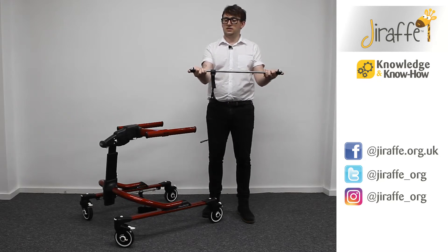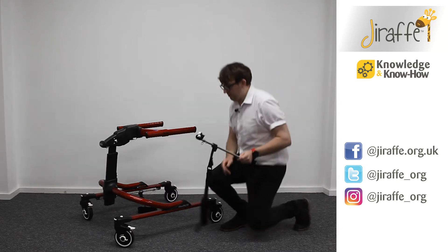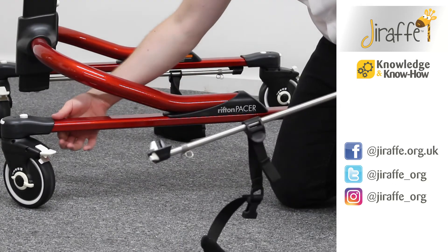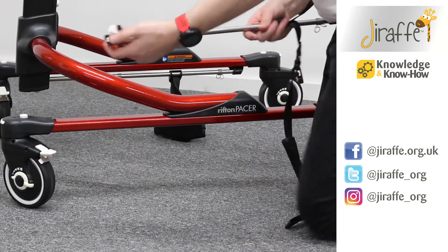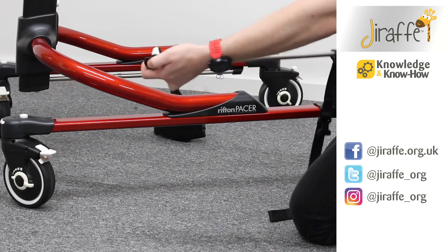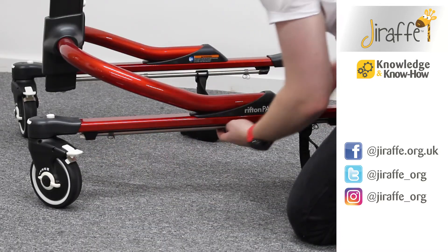Underneath the frame we have two grooves in the metalwork. We need to squeeze in the white locks, and once you find the grooves you can then release the white locks. That's now set the ankle prompt in place.